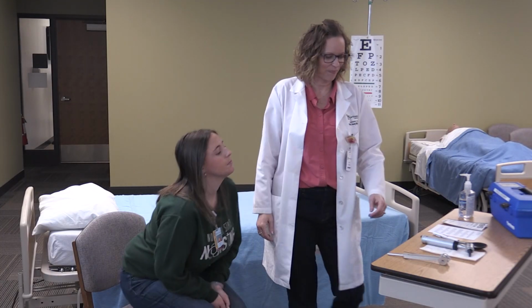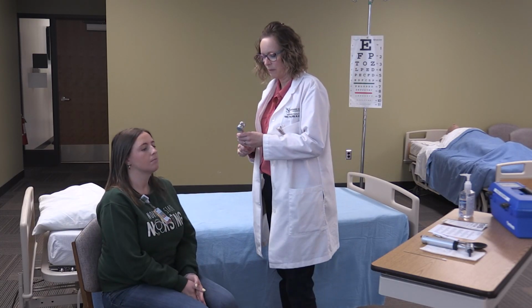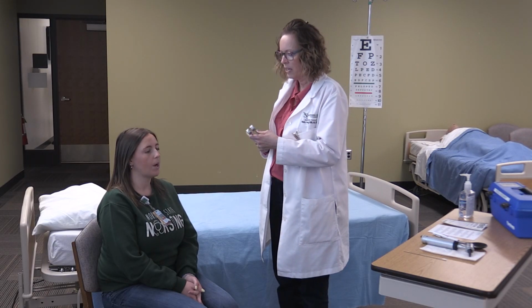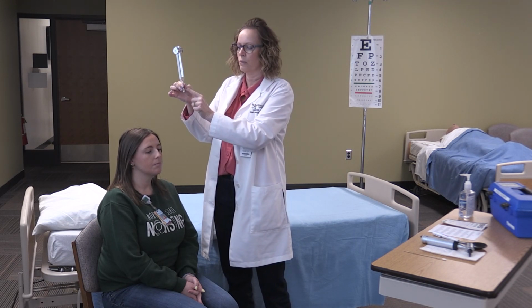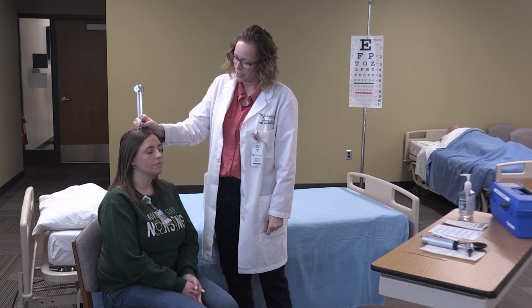Excellent. Okay. And then the Weber test is going to test to make sure that you can feel these vibrations on both sides of your head at the same time. I'm going to tap this, and make sure that you do not hold on to the top part because it will stop the vibrations. You want to only hold on to the stem here. You're going to place it on the top of her head. Do you feel vibrations on both sides? Yes. Okay, good. So that's the Weber test.